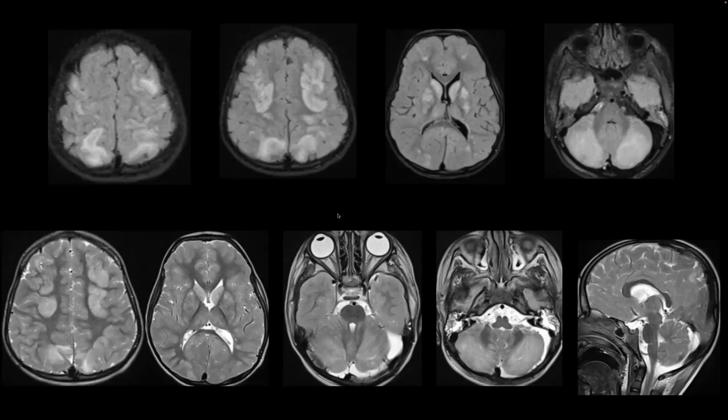FLAIR and T2 sequences again demonstrate these abnormalities in the deep gray nuclei, the subcortical cortical regions, and also the cerebellum. The only odd point for biotin thiamine was the involvement of the cerebellum, at least at this age. The early infantile ones can have cerebellar involvement, but usually at a later age it's the deep gray nuclei and the subcortical cortical regions. The cerebellar cyst seen on the left side is not related to the condition, at least clinically.